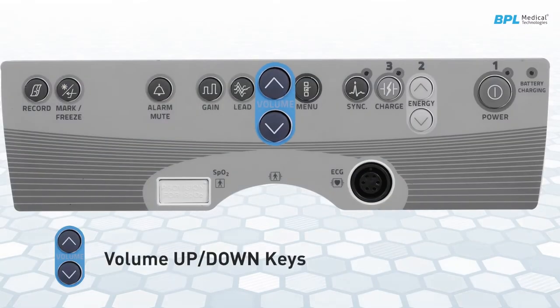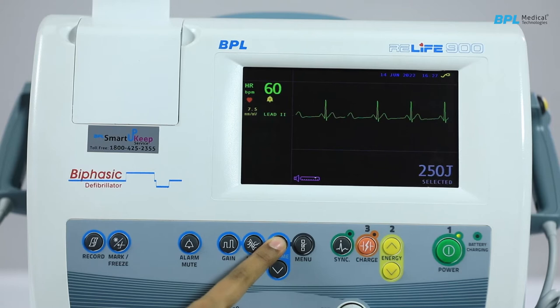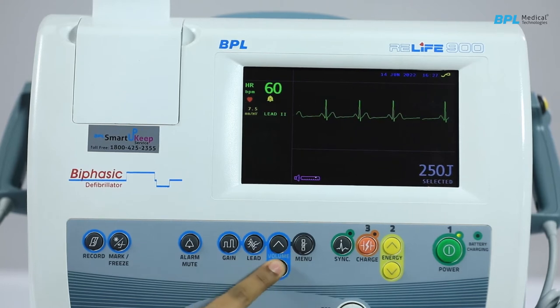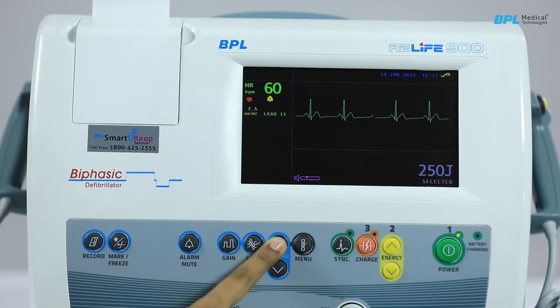Volume up down keys change the volume of the QRS beep. Two keys, up and down, are provided for changing the volume of the QRS beep. Pressing down decreases the volume and pressing the up key increases the volume.